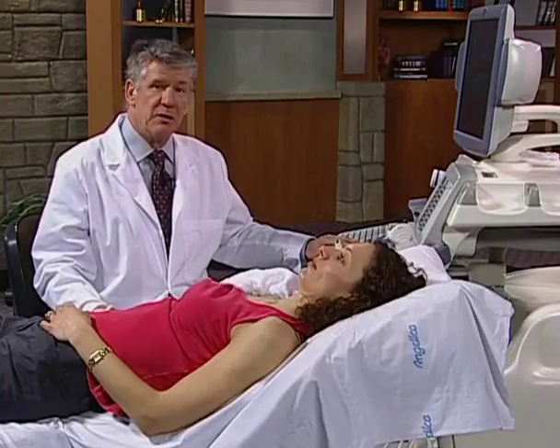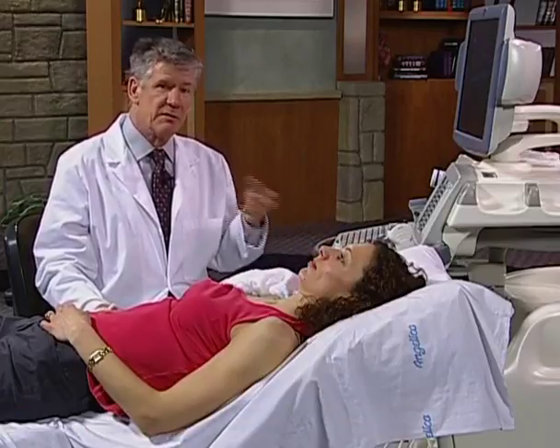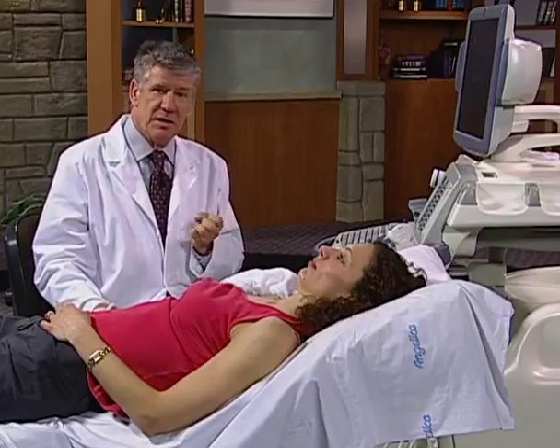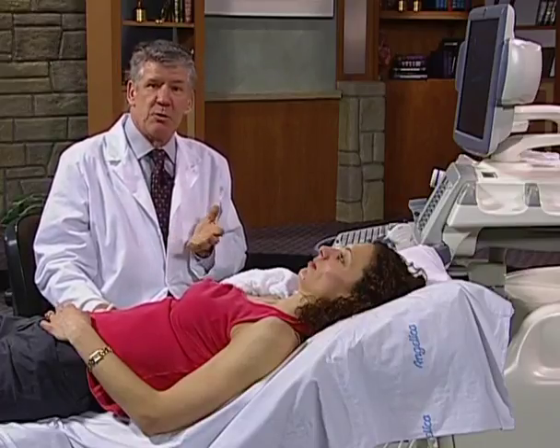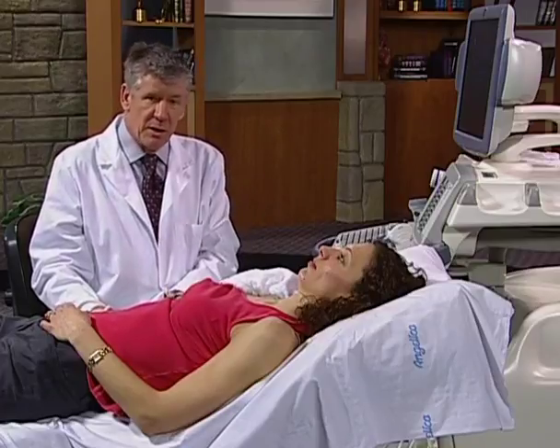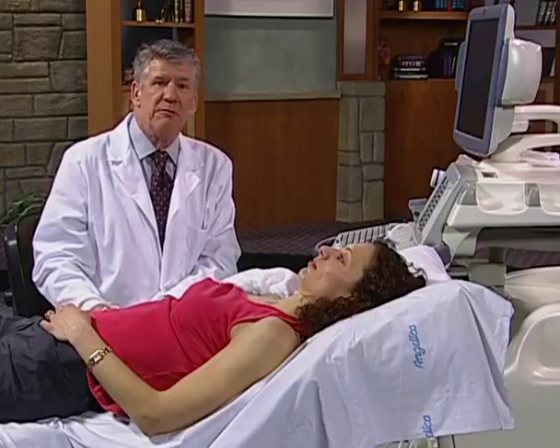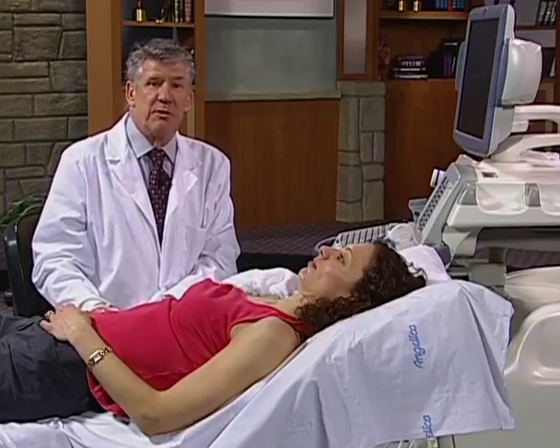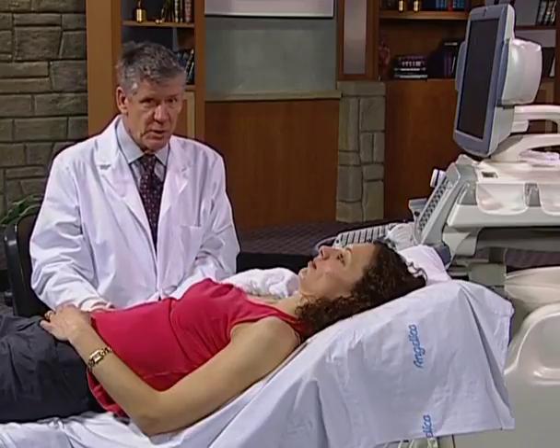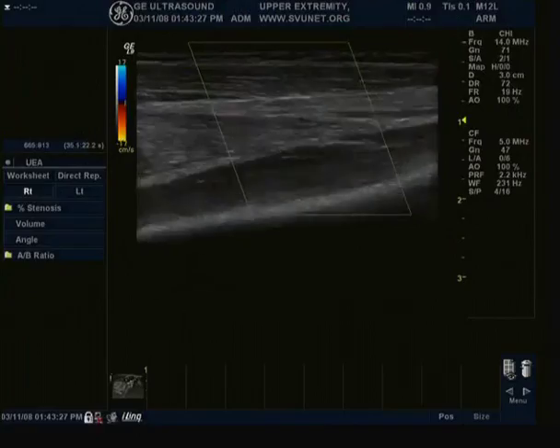in that the radial artery and the ulnar, and for that matter the brachial, are very reactive. The blood flow reacts to vasodilation in the hand. And it happens quite frequently. It happens due to temperature changes, emotional changes. So the waveforms that we see in a radial artery can vary quite a bit. They can vary from a very high resistant waveform, like we're seeing here, to a very low resistant waveform, actually sometimes just before our eyes. So I'd like to demonstrate that.